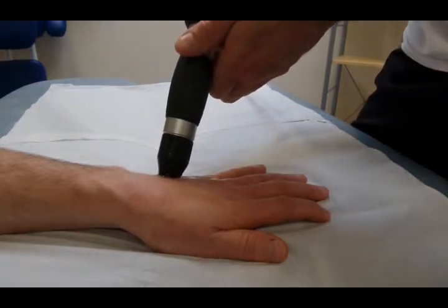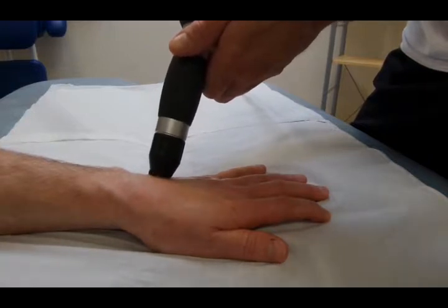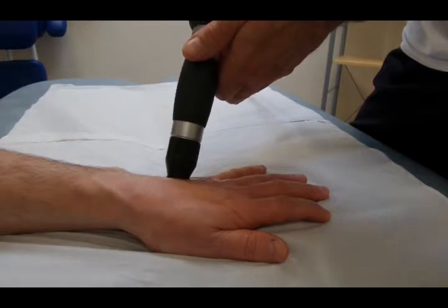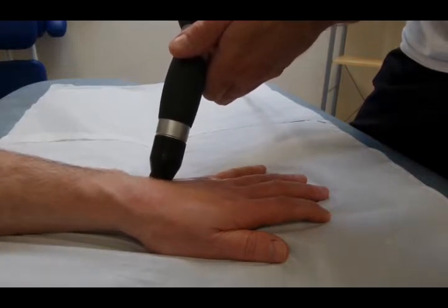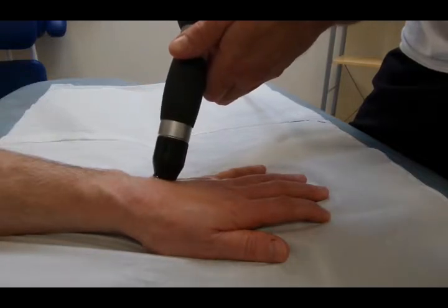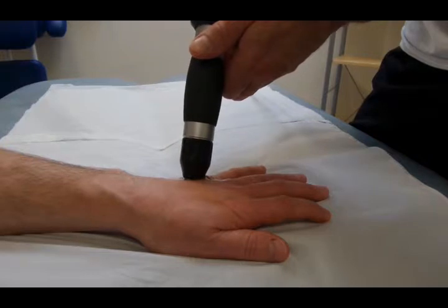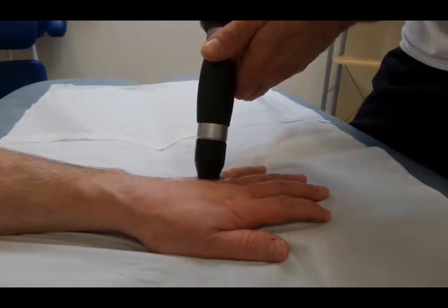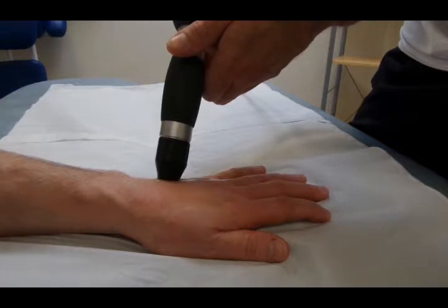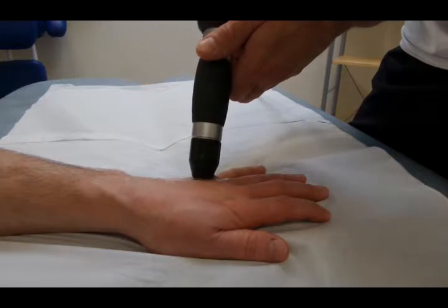Then we come back up to the carpometacarpal end and concentrate on that area as well. The scar tissue in the gutter seems to have cleared — there's a distinct gap now between the 2 metacarpal bones. The patient is much more able to make a fist. His strength is coming up in his hand; his power grip strength is returning.